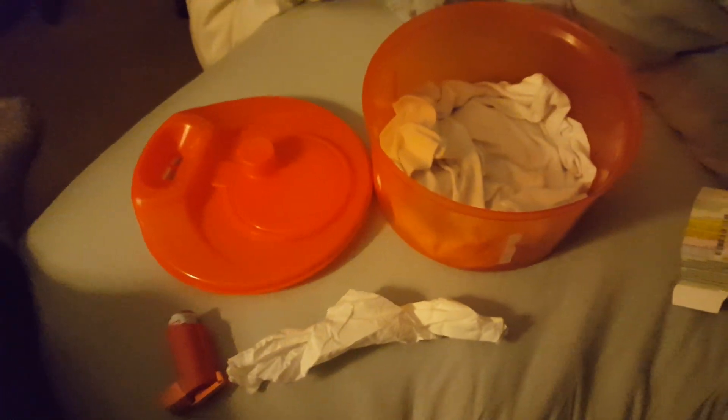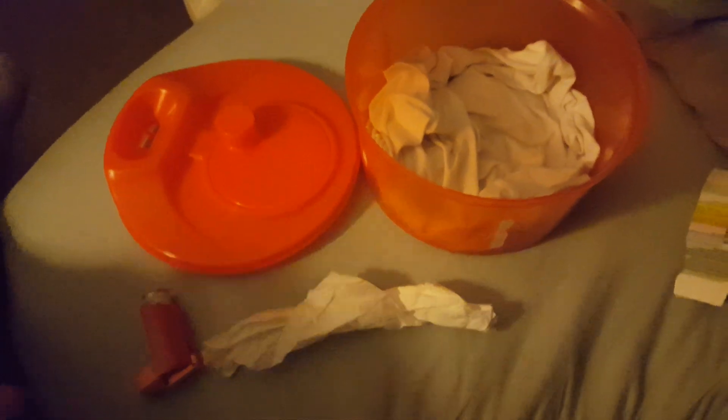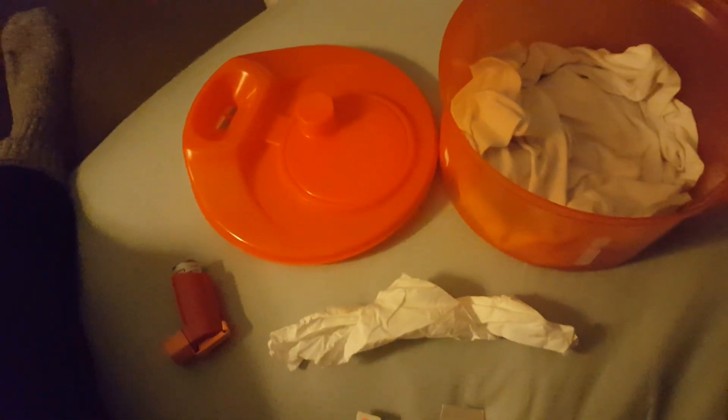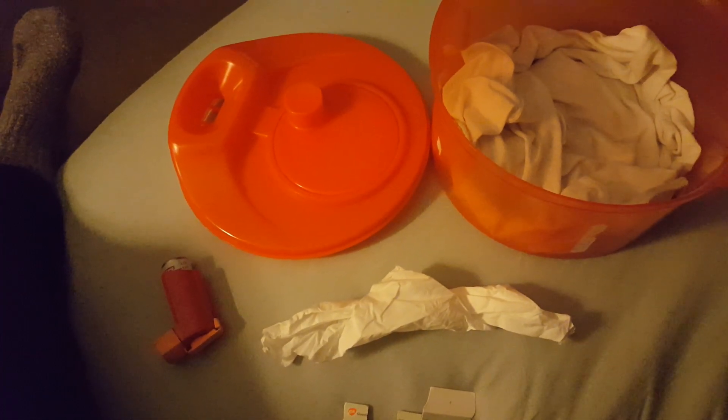I'm creating this video for those of you who have sick ratties and don't know what to do, but you have an inhaler. The inhaler is going to be the Flovent 110 micrograms.